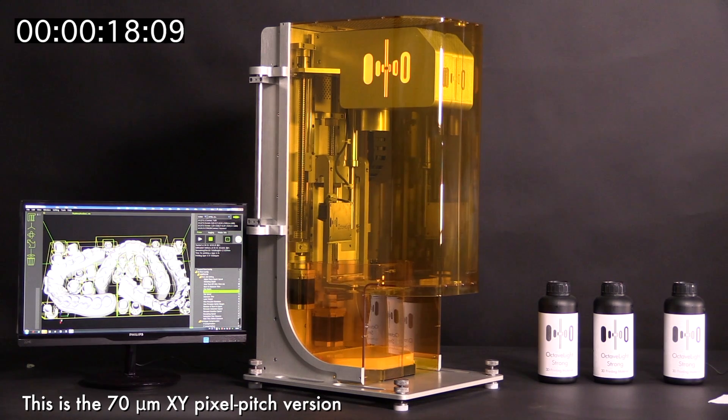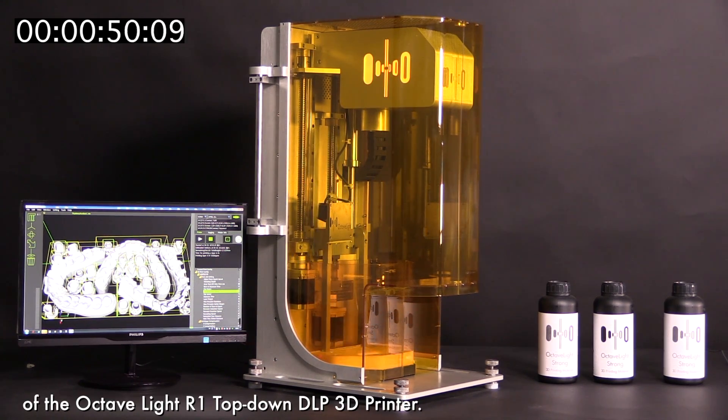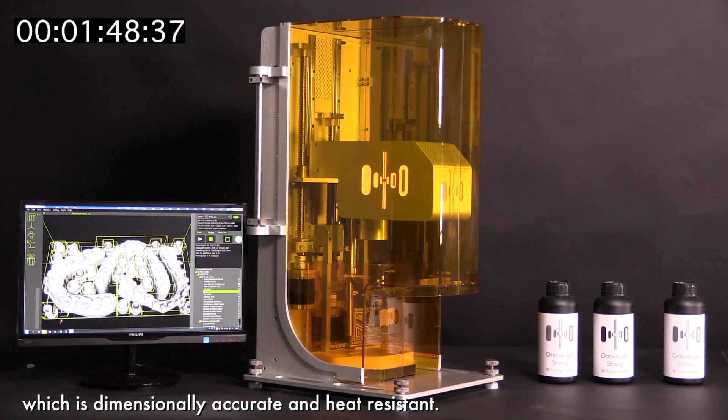This is the 70 micrometer XY pixel pitch version of the Octave Lights R1 top-down DLP 3D printer. We are using the Octave Lights strong resin, which is dimensionally accurate and heat-resistant.